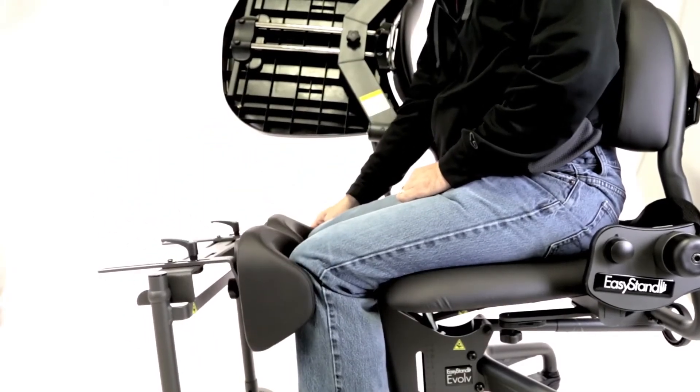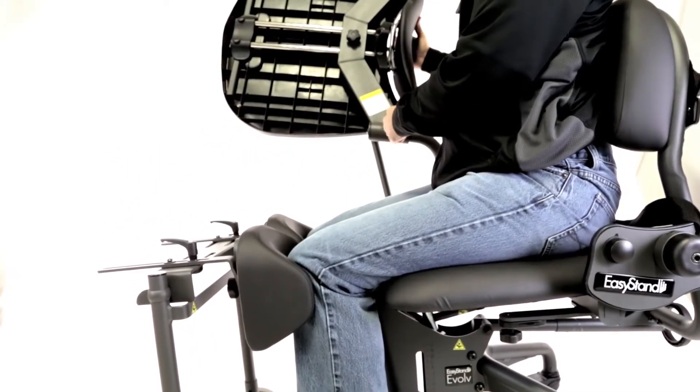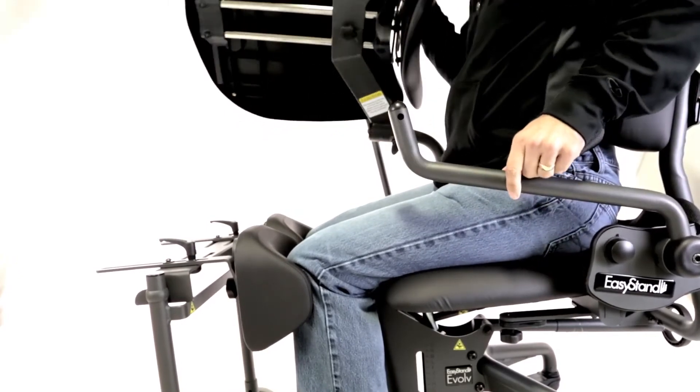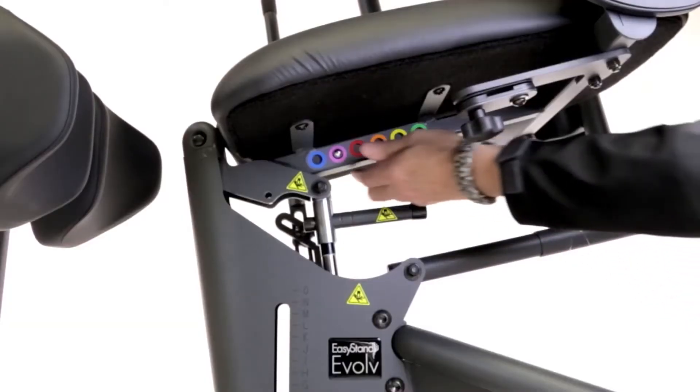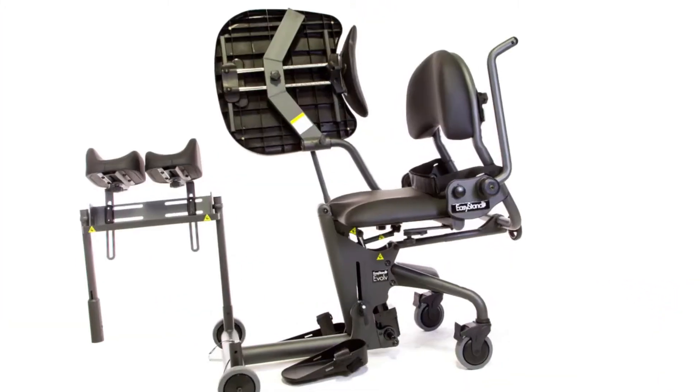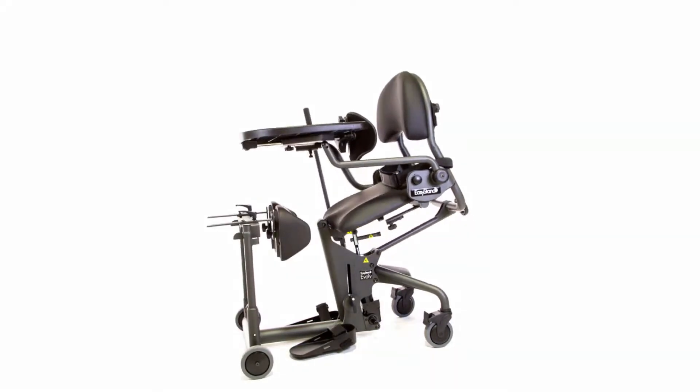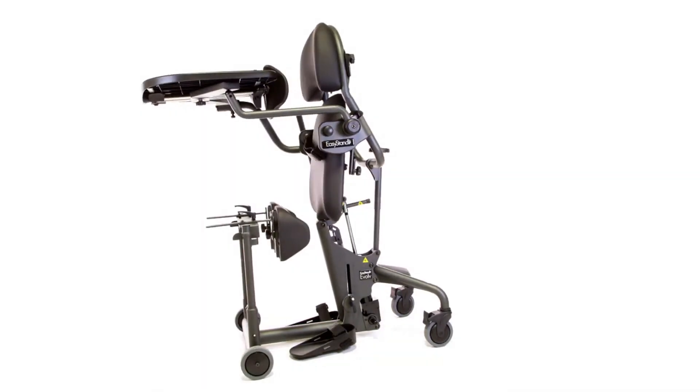The Evolve Standing Frame provides a safe and supportive transition to standing. It allows the user to stand in three easy steps: adjust, transfer, and pump up. The optimal standing position has been perfected in the Evolve Standing Frame.